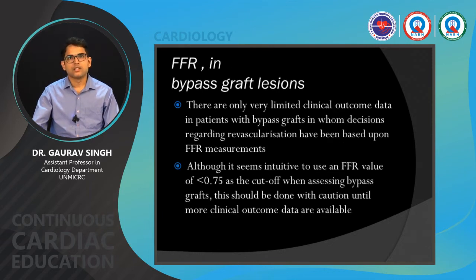FFR in bypass graft lesion. There are only very limited clinical outcome data in patients with bypass graft in whom decision regarding revascularization has been based upon FFR measurement.